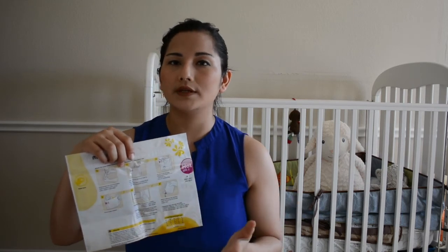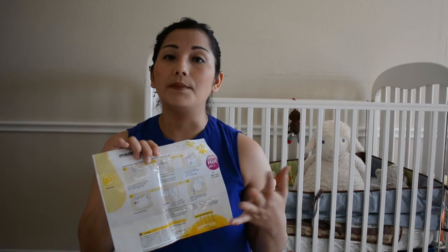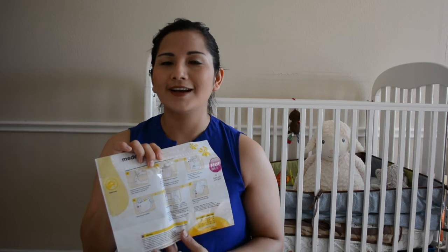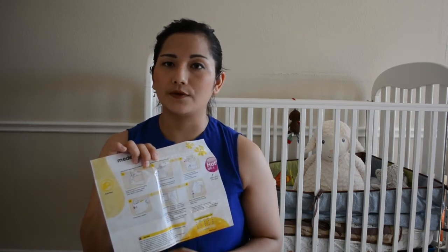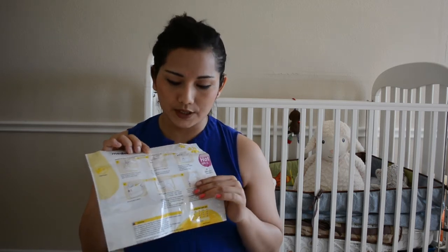Once you seal it, you put it in the microwave. There are three different timing settings depending on your microwave's wattage. What I found for my mom, my sister, and myself is that most microwaves are 800 to 1100 watts — that's a safe range to go with. You can check your microwave's manual or look up the brand. Mine was 800 to 1100 watts, so I put it in for three minutes.